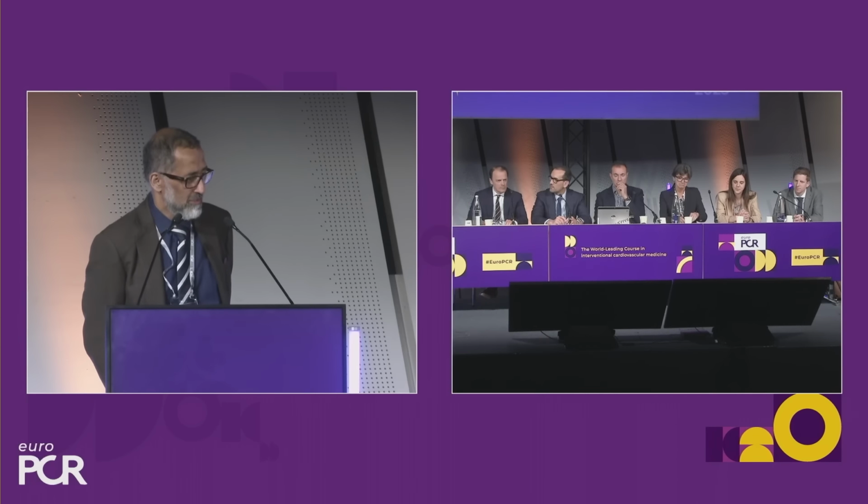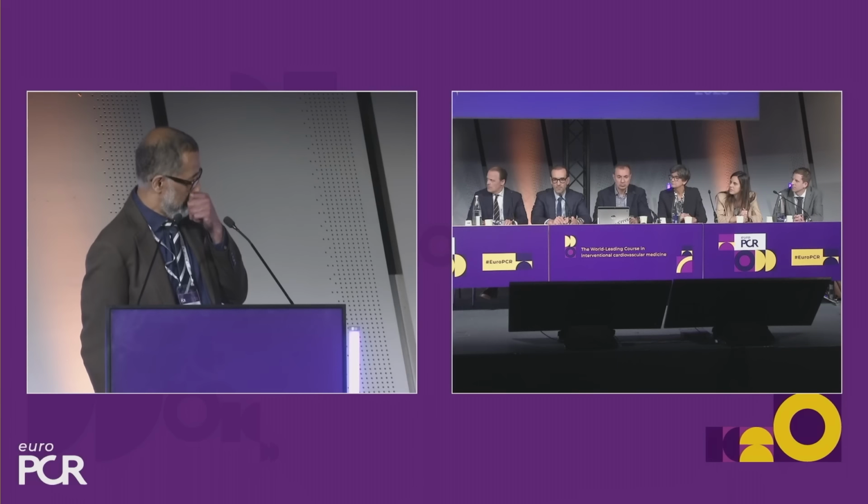There's been one patient ever that I've stopped the TAVI because of what the coronaries were doing. And that was someone who I was going to plan axillary access because there was no other access. So I did a right radial angiogram first. He had a critical right coronary lesion with breathlessness as the only symptom. So I said, look, 5 or 10% risk TAVI versus a 1% stent. I'll do the stent and see how you go. 3 years later, he's still got no symptoms. He's still got severe aortic stenosis.